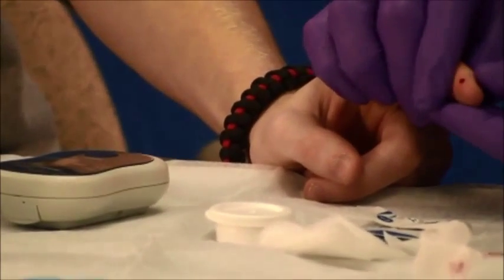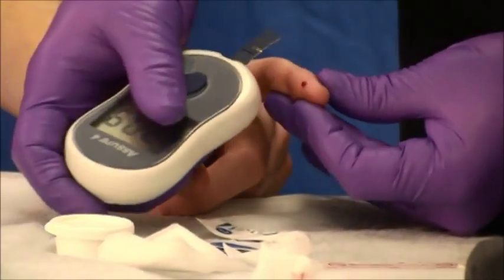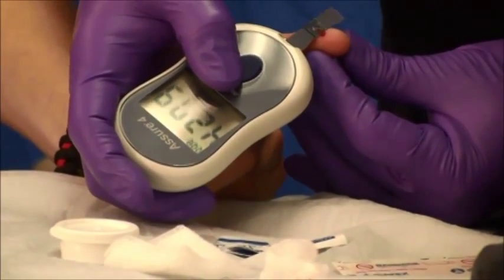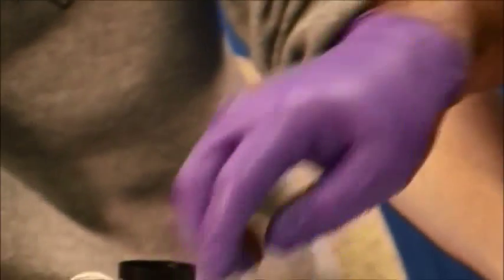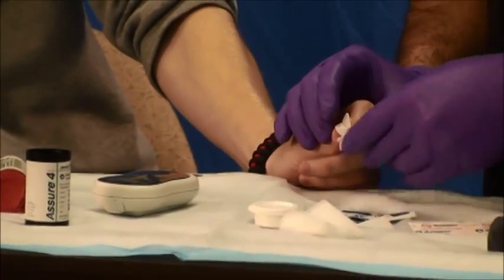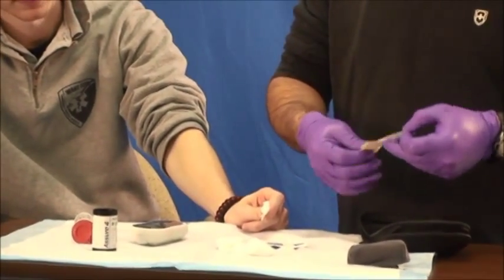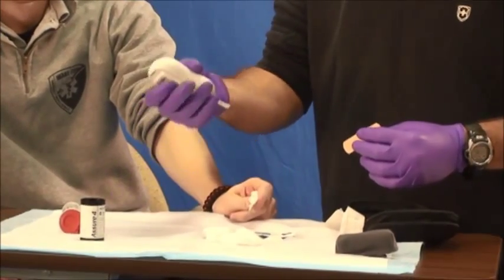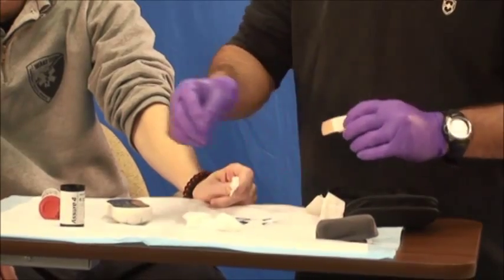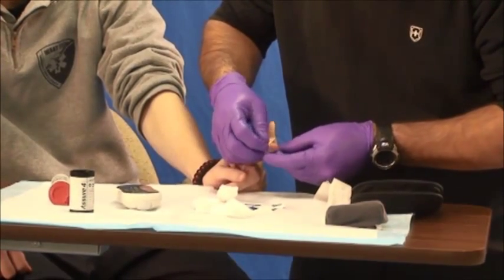Squeeze a sufficient amount of blood and place your strip next to the drop so that it will soak it up. Have the patient hold the two-by-two. Then read the number on the screen — that would be your patient's blood sugar. Make sure to place the band-aid on the patient's finger so they don't bleed all over the place.